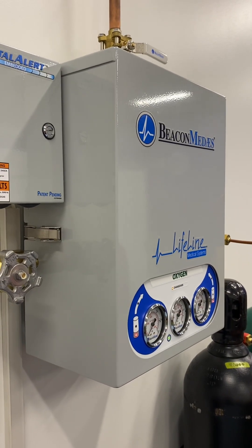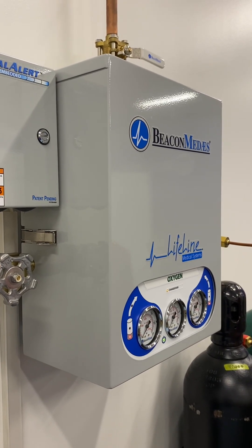Today, we're going to talk about rebuilding the bank regulator on the Lifeline Global Manifold.